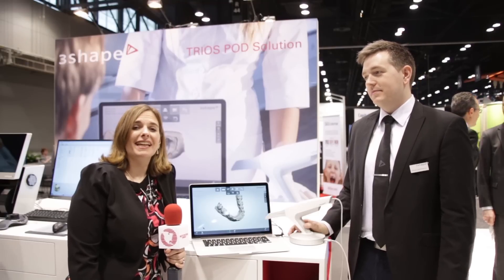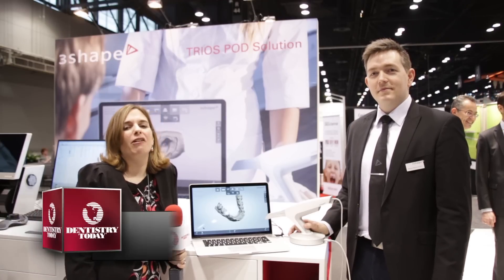Hi, I'm Ali Cook for Dentistry Today, coming to you once again from the floor of the Chicago Midwinter Meeting. Right now I'm at the 3Shape booth where I'm joined by Morten Ride, who is product specialist and trainer for the TRIOS system. Morten, what do you have to tell us today?